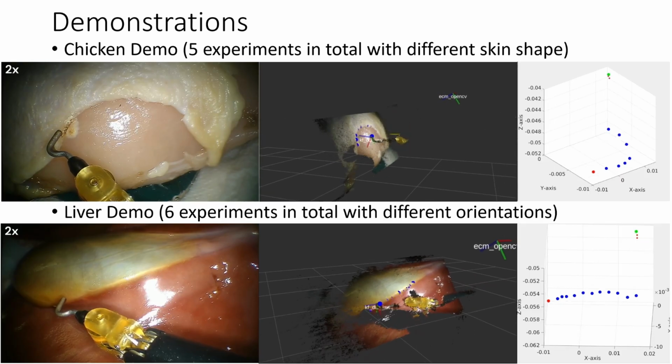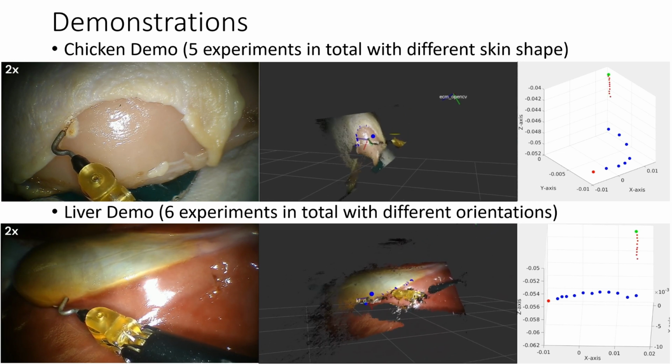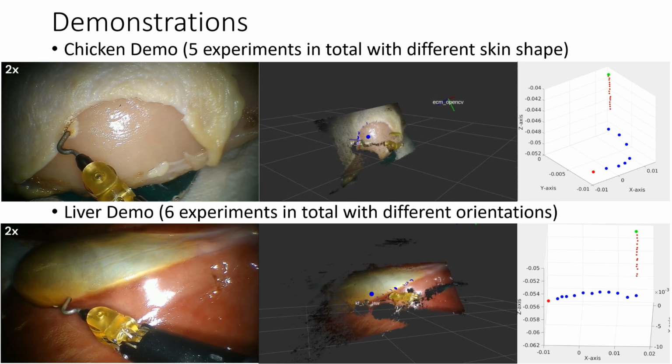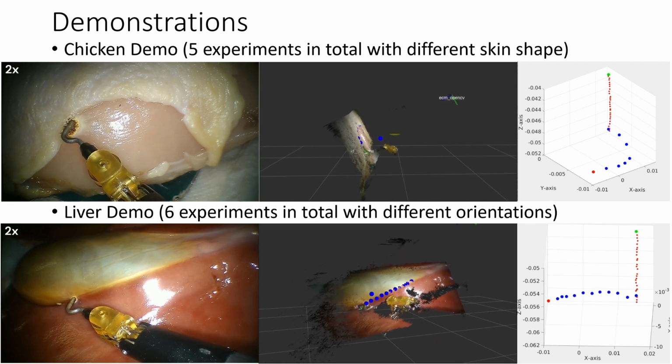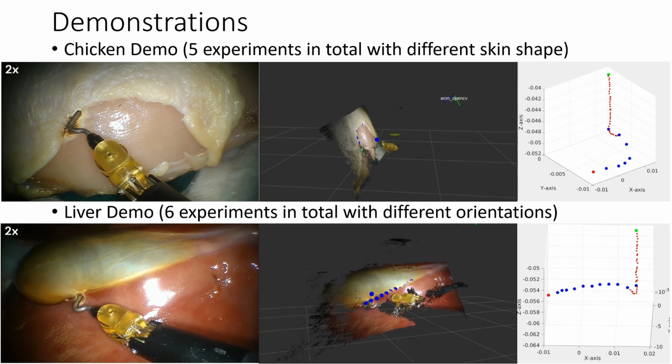In this slide, we demonstrate the ex vivo procedures. The top row highlights experiments on chicken specimens, while the bottom row focuses on pig livers. On the left, you'll see the endoscopic images taken during the procedure. The center column presents the generated point clouds with the corresponding trajectories displayed on the right.